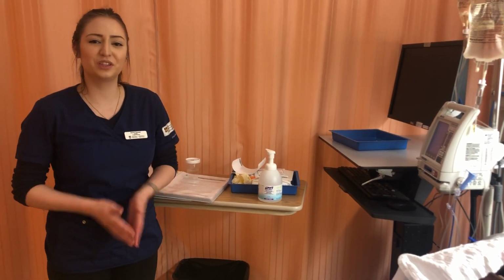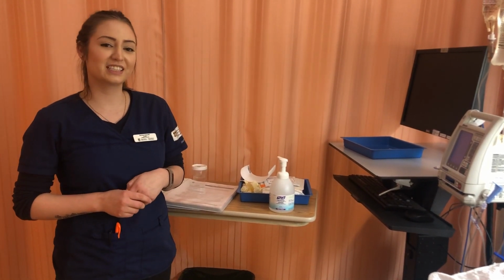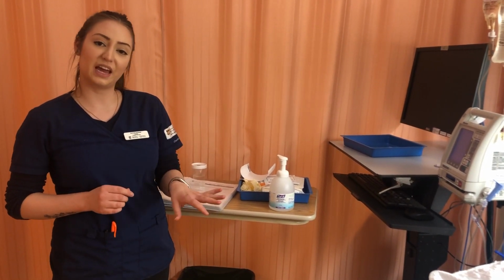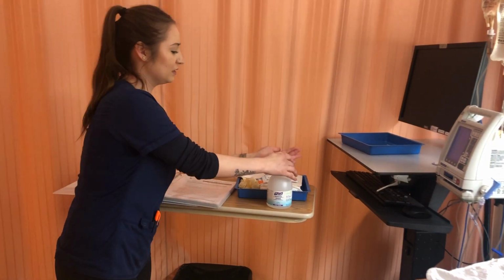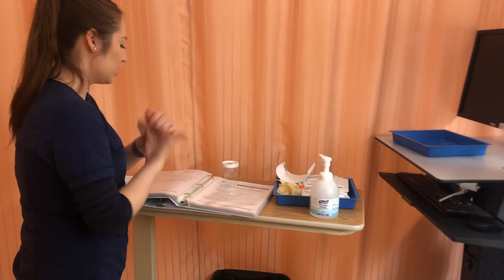Hi, I'm Savannah. I'm a student nurse, and today I'm going to be showing you how to administer an insulin infusion via continuous IV, as well as do a chest tube dressing change. So, to start, I will perform hand hygiene, and I'm going to just look at my orders.